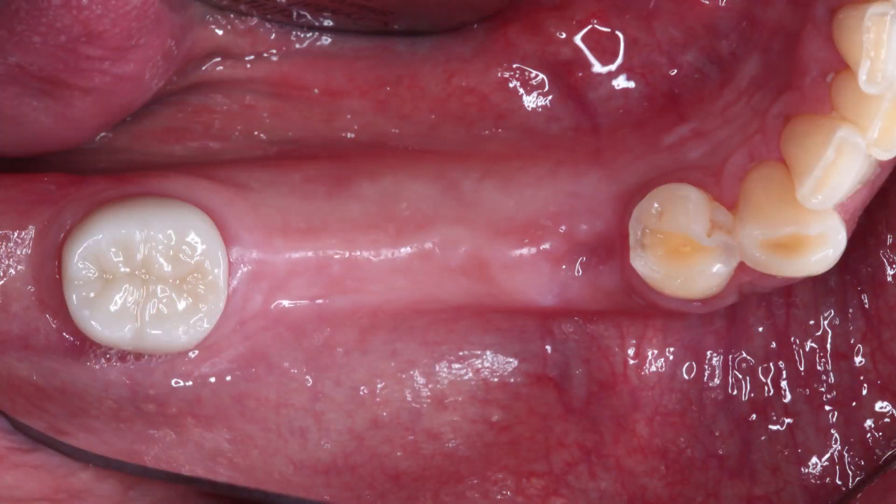Hi everyone. Welcome back to another episode of Chairside Live. My name is Dr. Bai, and I am going to go over a case which is a little bit more challenging — a step above your basic simple implant placement. The patient presented with an edentulous residual ridge in the mandibular right posterior. The patient was missing teeth number 29, 30, and 31. The patient has an existing crown on tooth number 32 and a mesiodistally fairly wide ridge. To determine buccolingually, my technique is to review a cone beam CT scan, but we'll get there in a little bit.